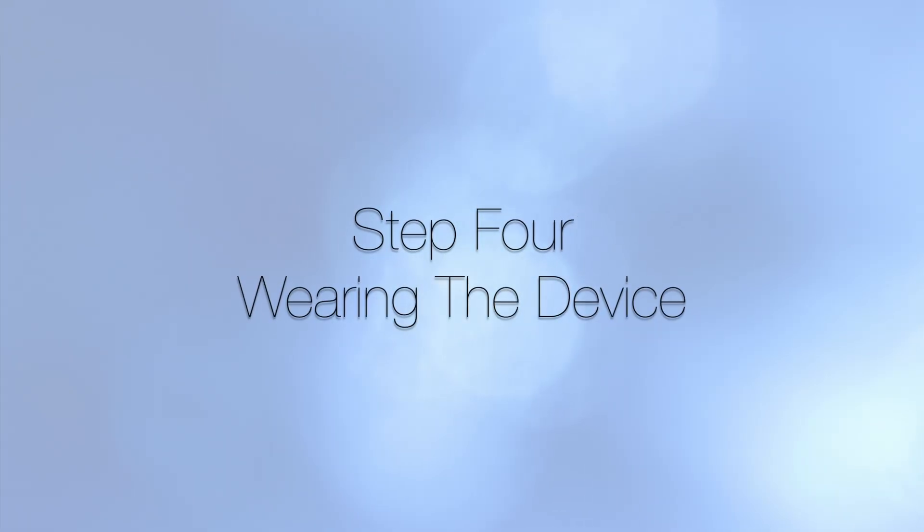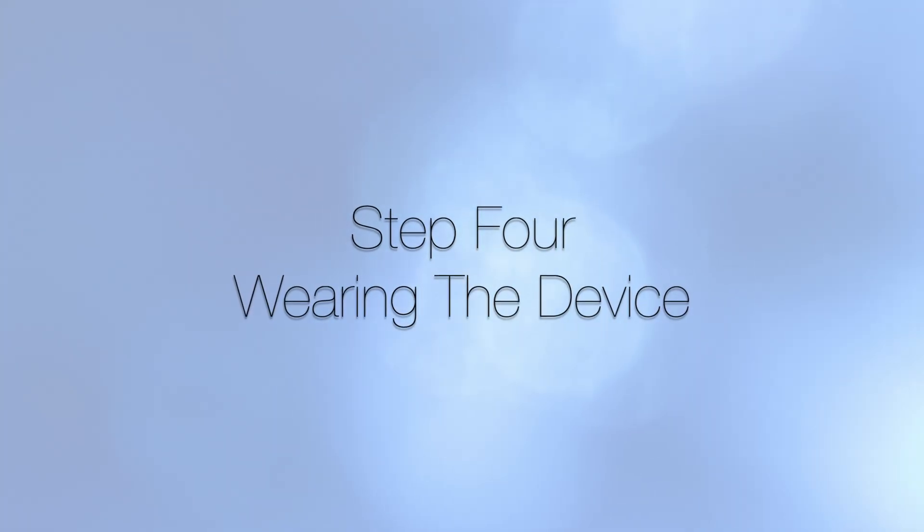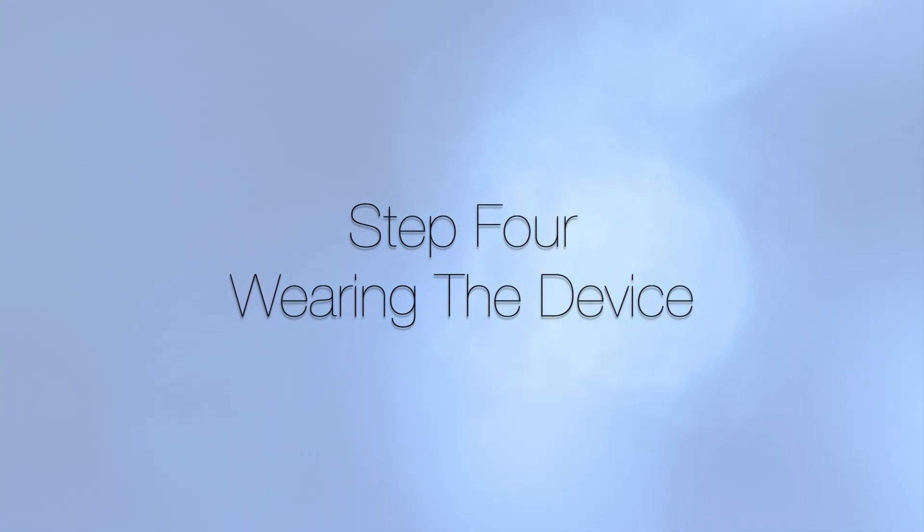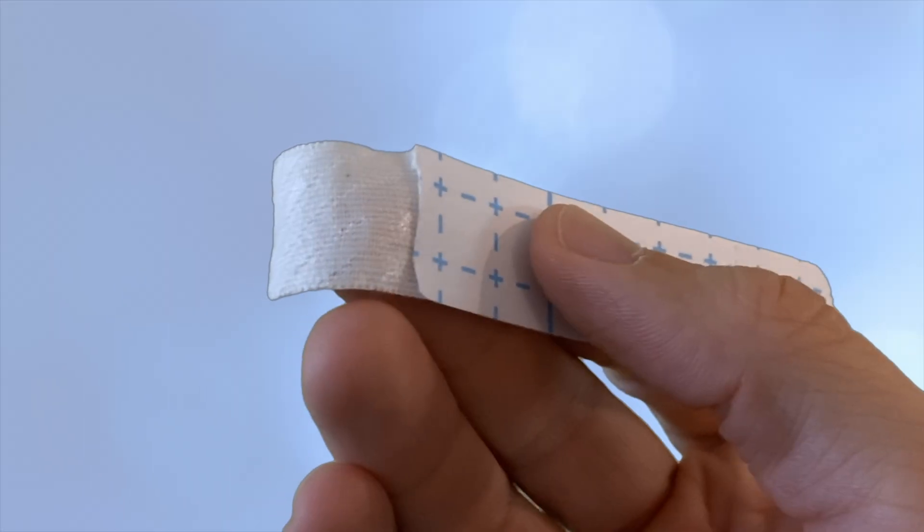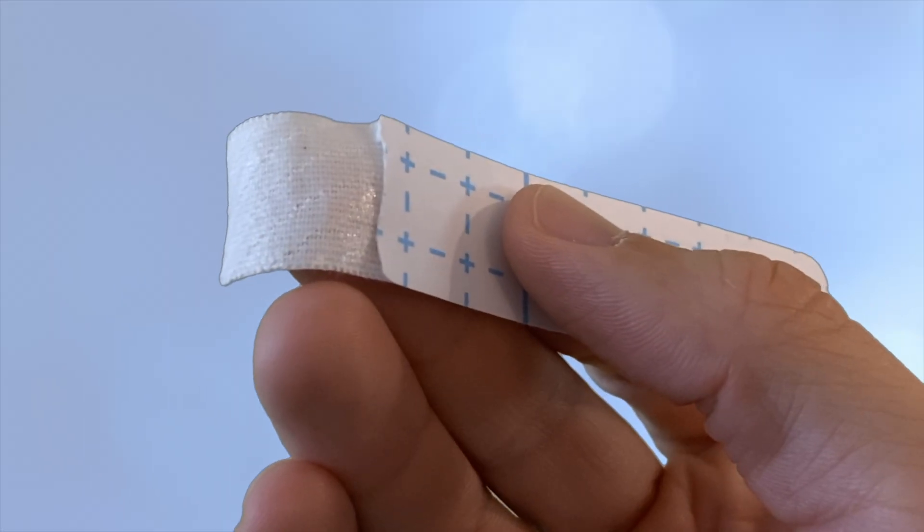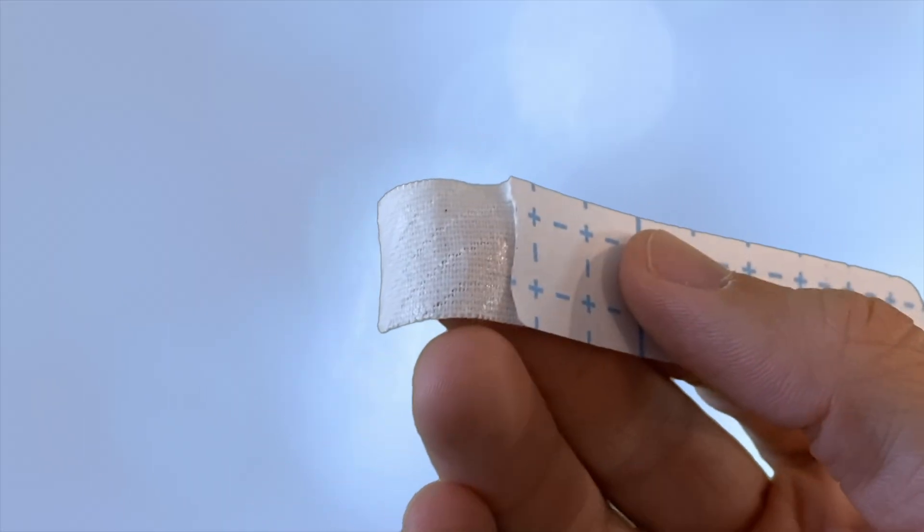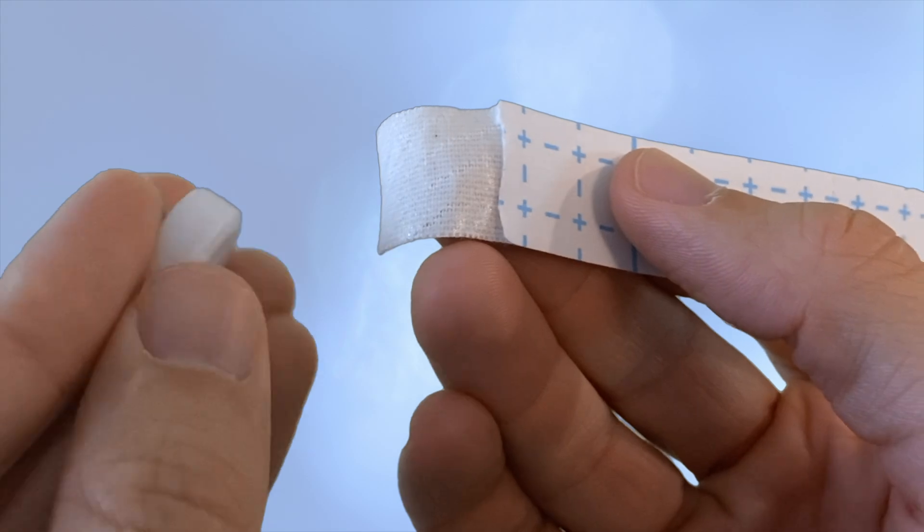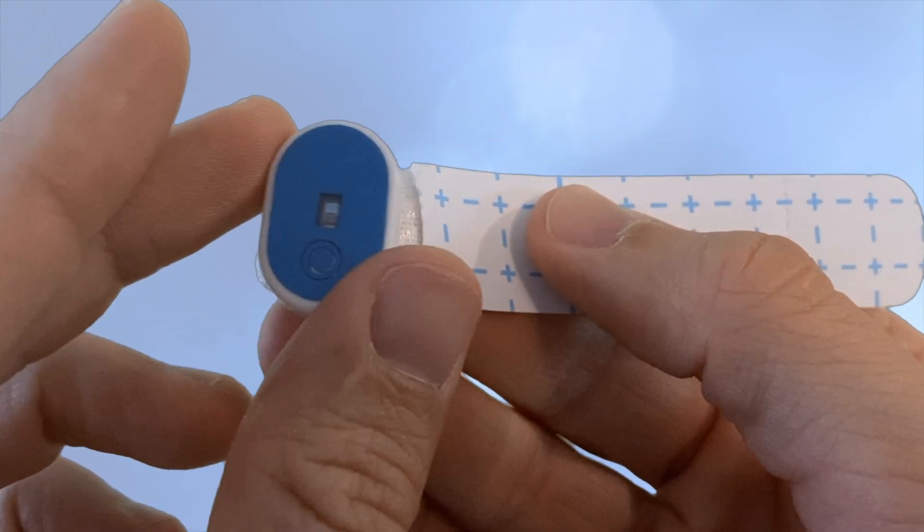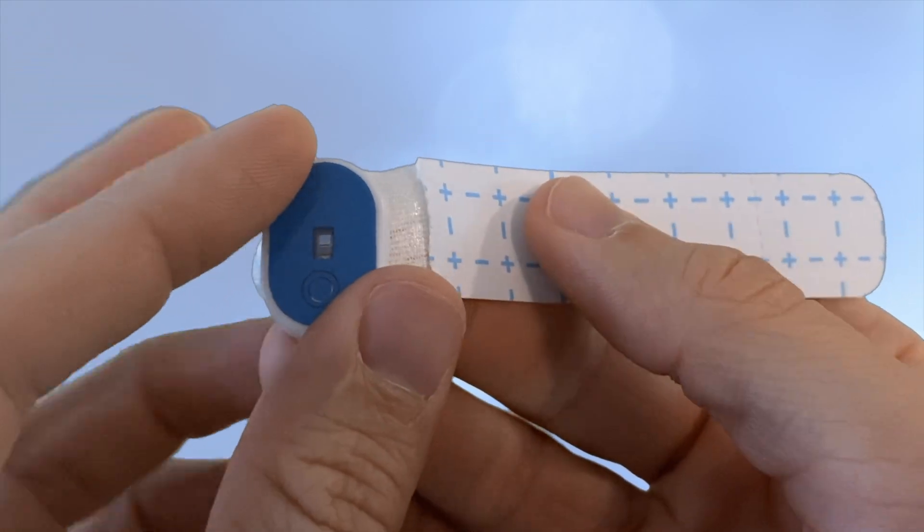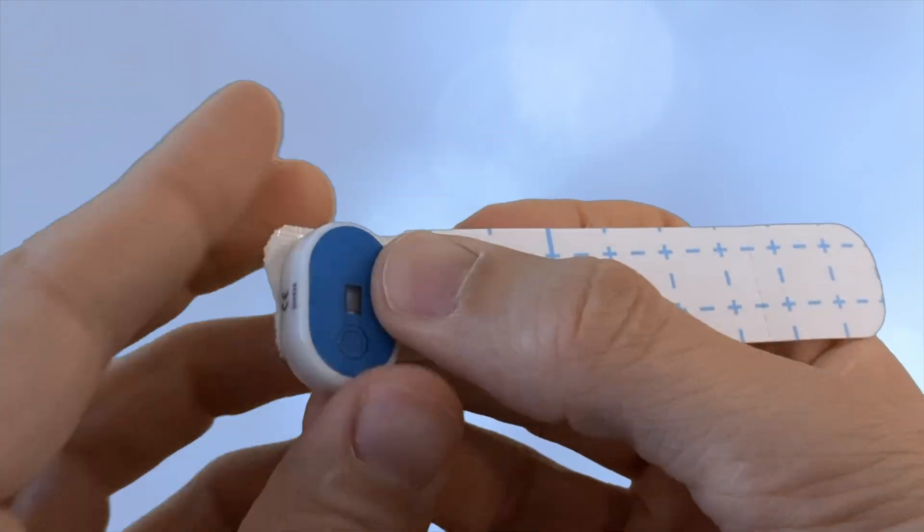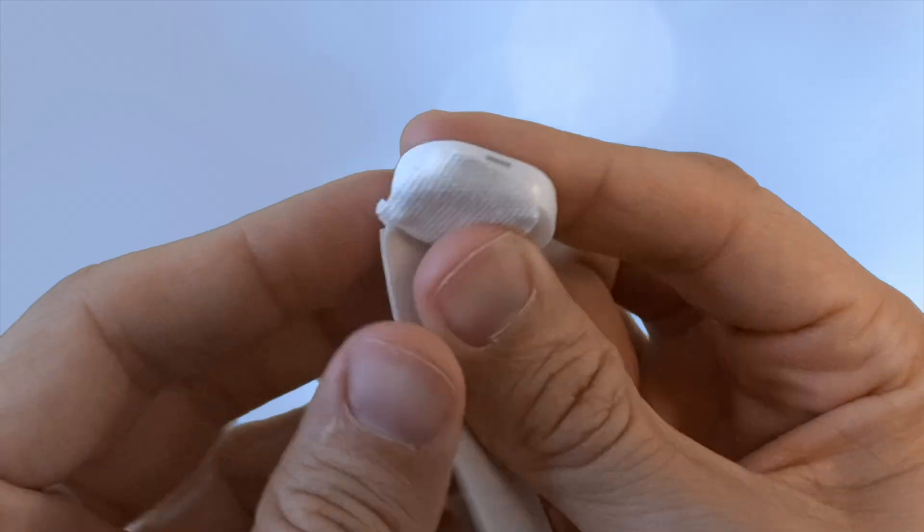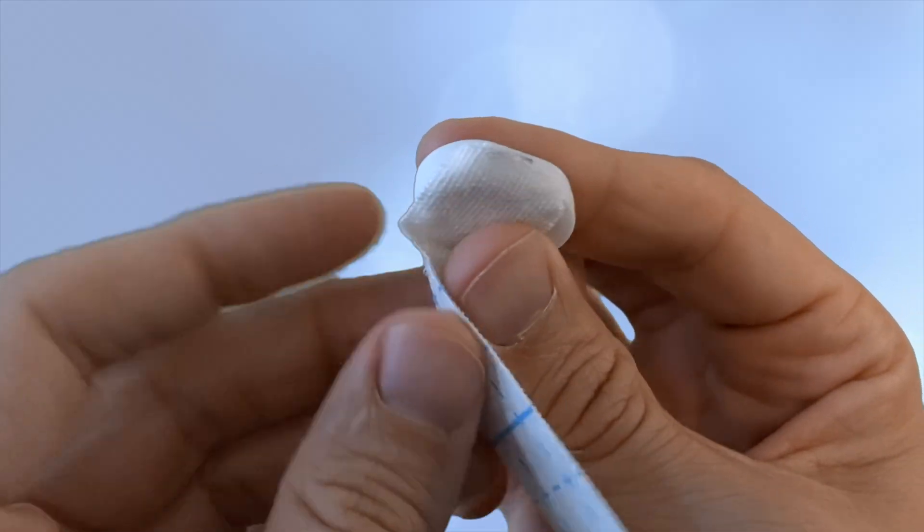Step four, wearing the device. Let's put the device on. To begin, remove the adhesive cover from one of the finger straps. Place the white side of the Night Owl device at the corner of one of the straps.